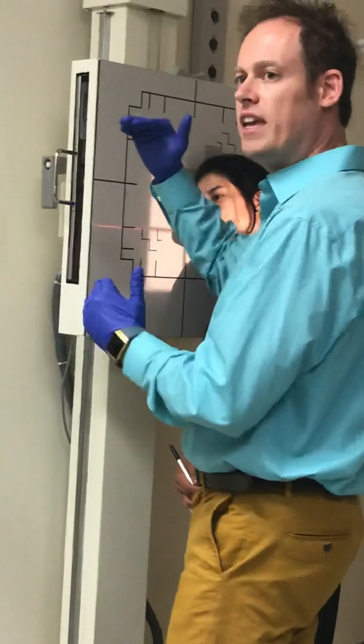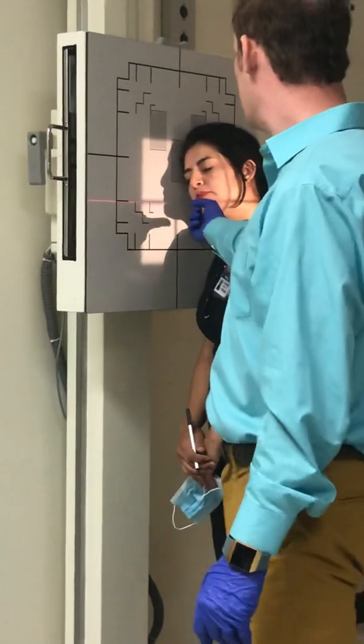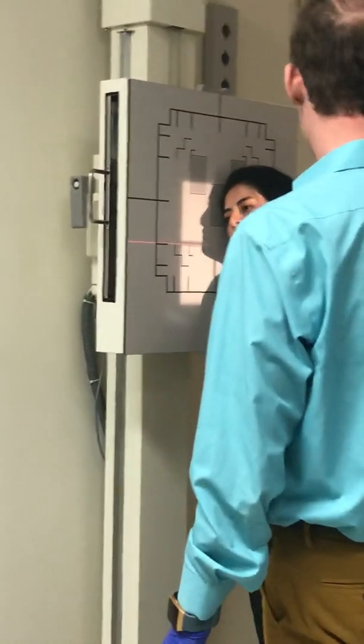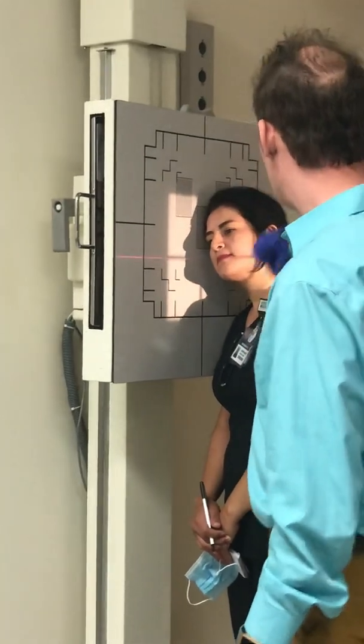I'm going to step away and tilt the head in 15 degrees. At that point, I have her head exactly how I want it to be. I'm also going to tip her chin up just a little bit — make sure you tip that chin up. It's still going to be right on the gonion, so make your adjustments. Right on the gonion.